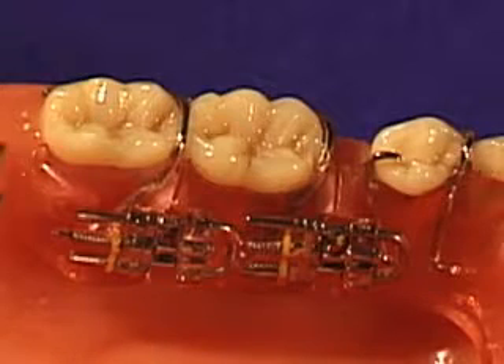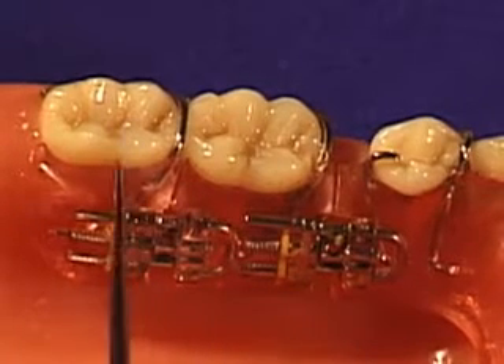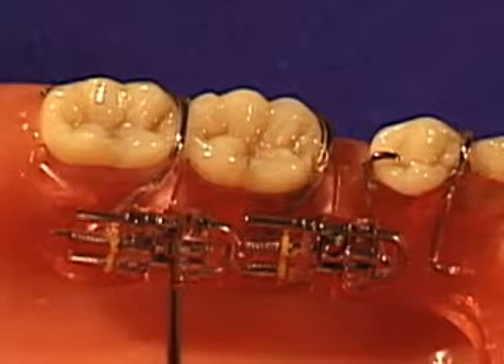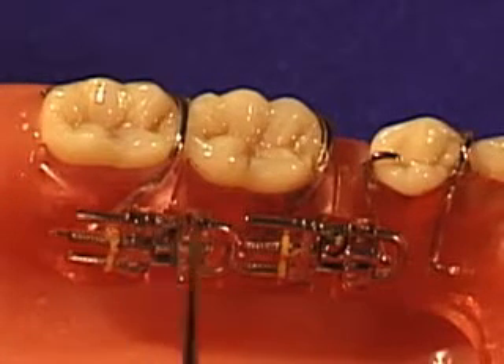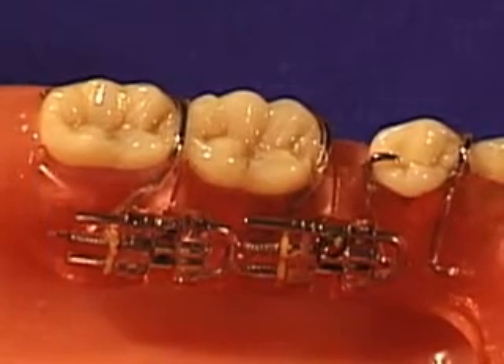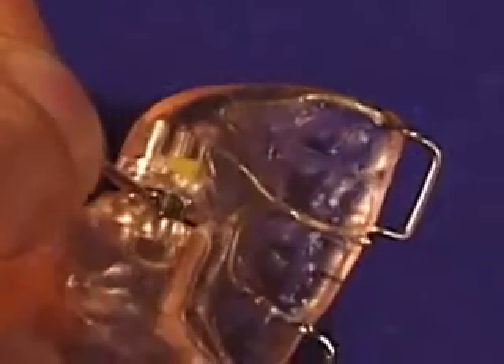The adjustment sequence is as follows. First, adjust the expansion screw between the first and second molar, which will move the second molar distally. This screw is opened like all expansion screws — one quarter turn once a week with your expansion screw key, moving towards the tip of the arrow.